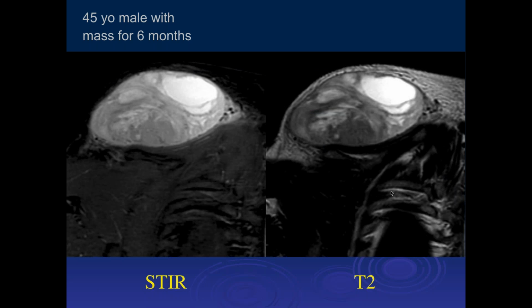Okay, for the next case, it's a 45-year-old male with a mass for 6 months. This seems to be the region of the acromioclavicular joint.